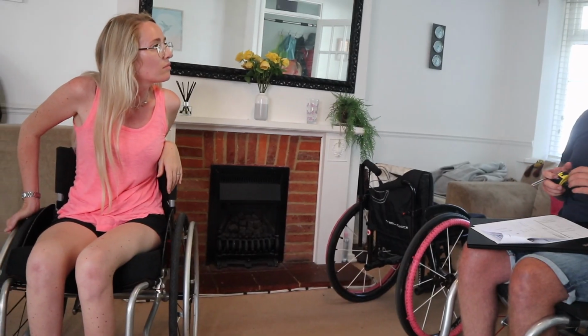Other one, fine. But if you're getting a little bit confused by me saying I liked what was on the other Jaguar, that is when I tried the other Jaguar back in 2020, and the setup on it was amazing. It was just a little bit too small for me, but quite a lot of those aspects I wanted to carry through onto my new chair. The other one had a bit more bucket, I believe, than this one.